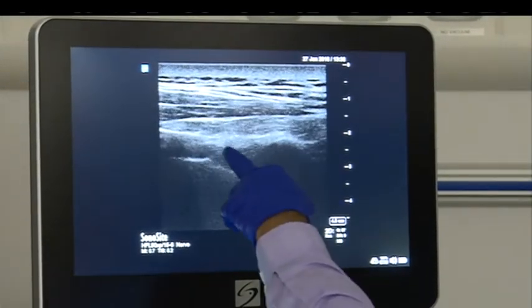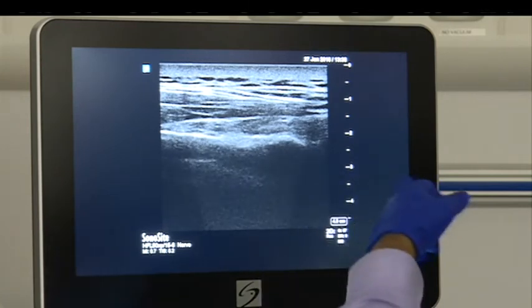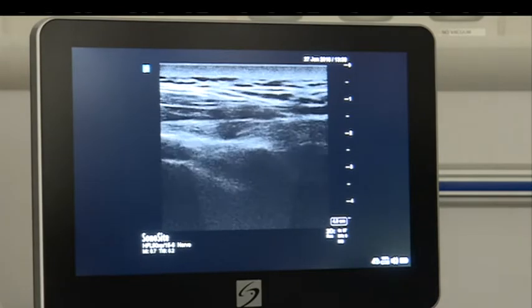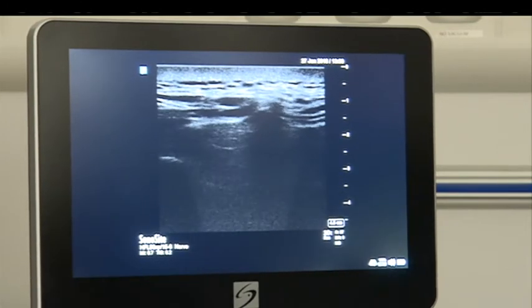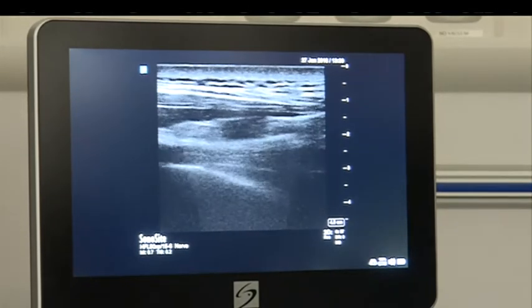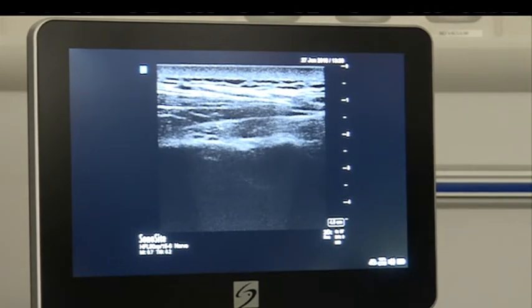You see some bright white line there, and that hump — that is your transverse process. That confirms it because the rib joins with the transverse process. You can also go more medially — that shadow is basically of the spinous process — and then move laterally again keeping it on the rib. That hump is your transverse process.